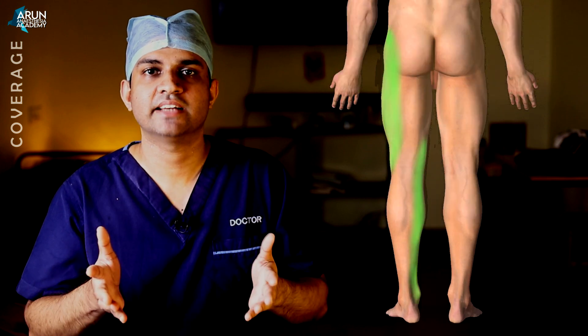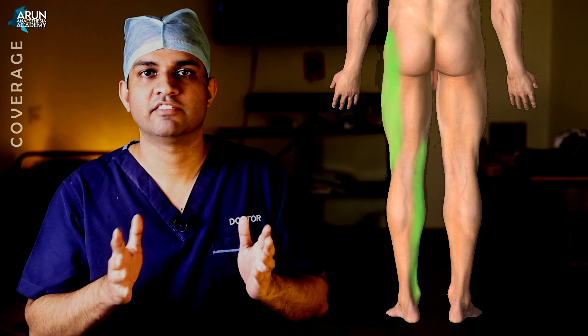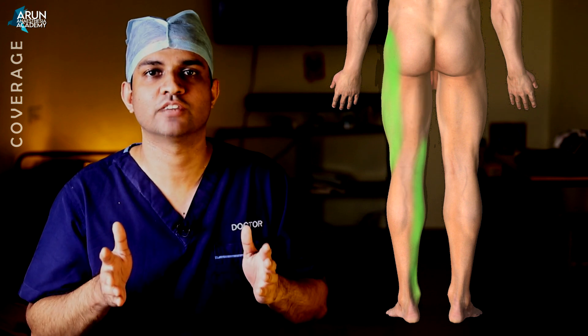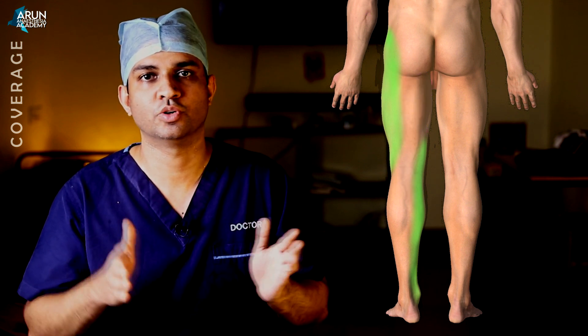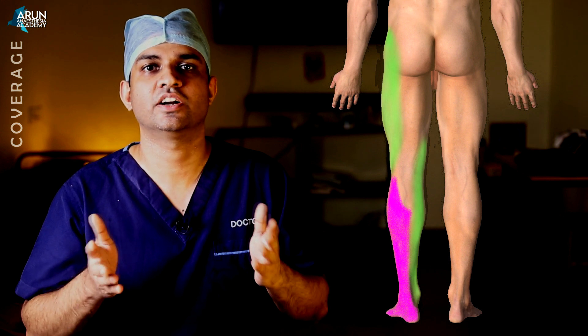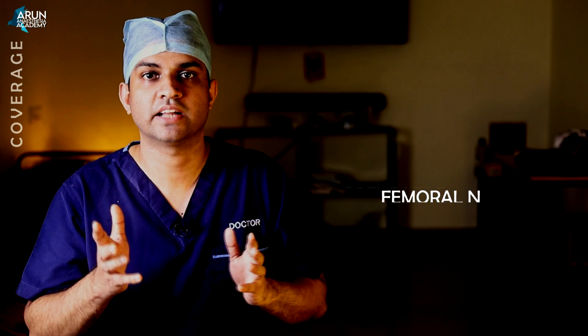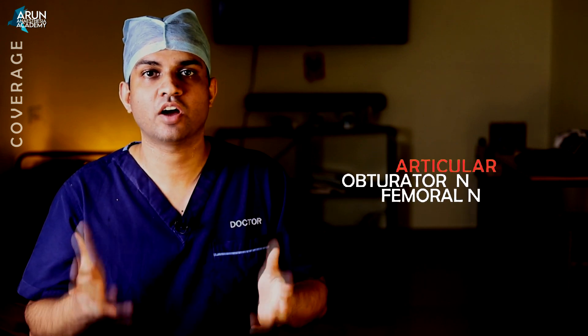In the posterior thigh, the lateral part will be affected due to the lateral femoral cutaneous nerve, more likely with the suprainguinal approach. The upper posterior thigh, supplied by the posterior cutaneous nerve of the thigh — a branch of the sacral plexus — is not affected. Below the knee is supplied by the sciatic nerve, also not involved. The osteotome supply is almost the same in both approaches because the lateral femoral cutaneous nerve has no osteotome supply. Experts say that femoral nerve branches and possibly obturator branches supplying the hip are more likely to be blocked with the suprainguinal approach.